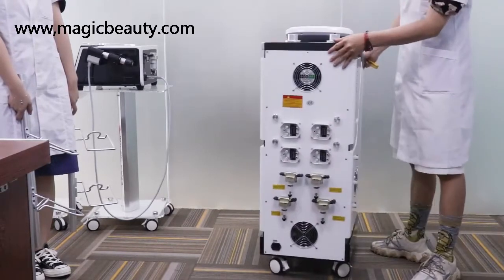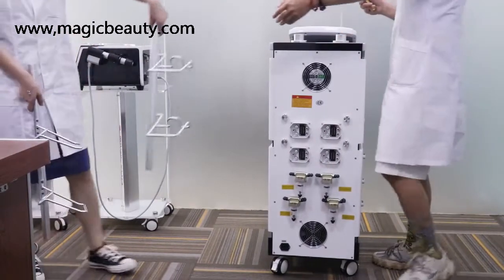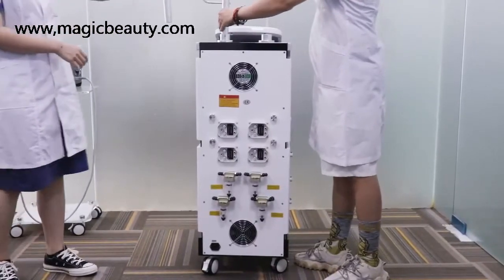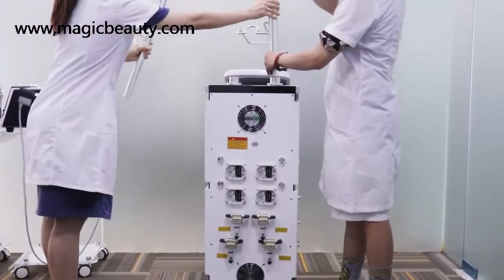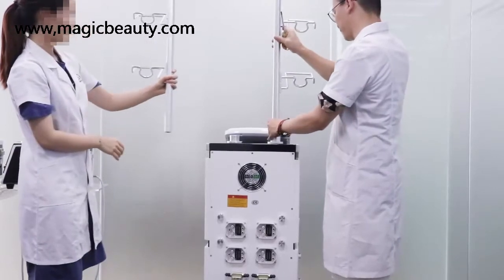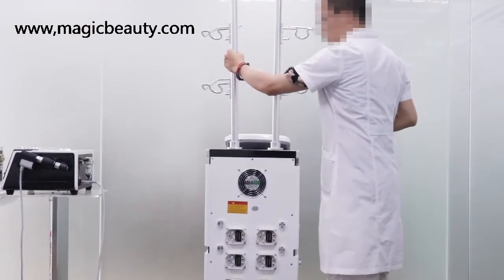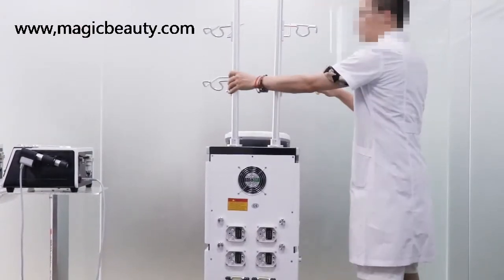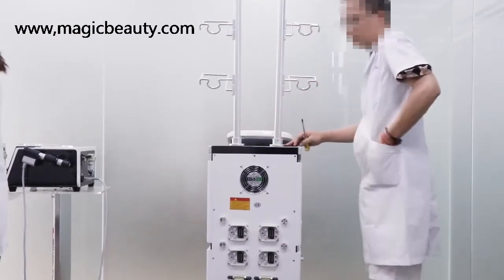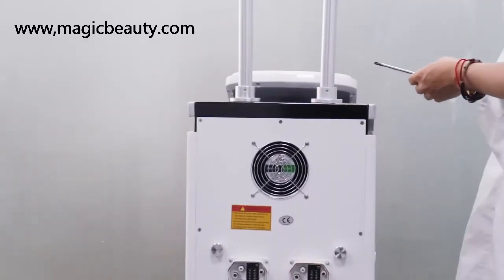Firstly, you need to put the handle holders onto the machine first. These are the handle holders on the two sides. They have to be on the right side, because if it's not on the right side, you can't put the handle on the machine. This has a few screws — we need to fix the screws first, near to the handle pieces.